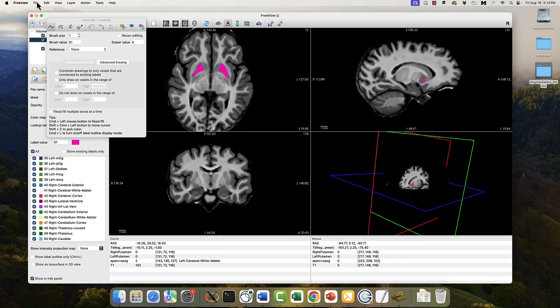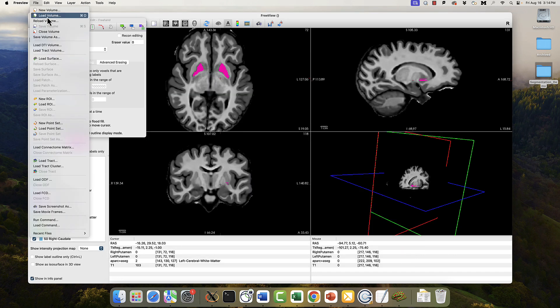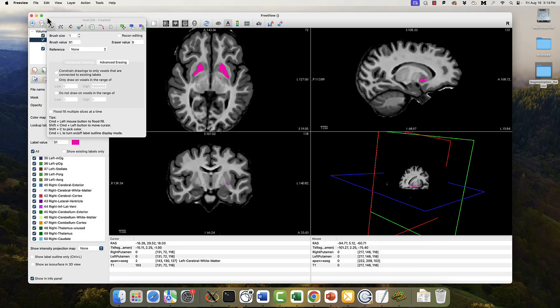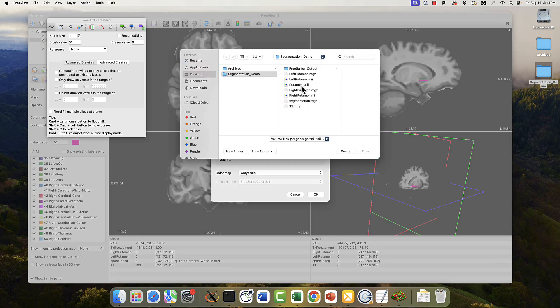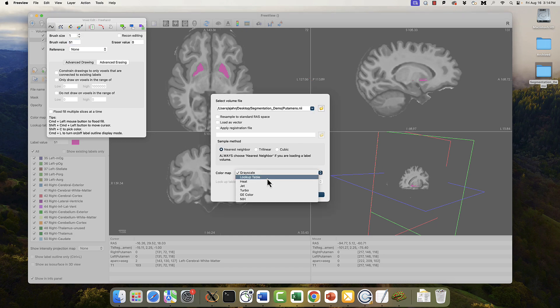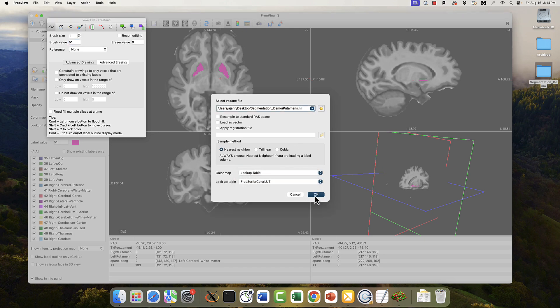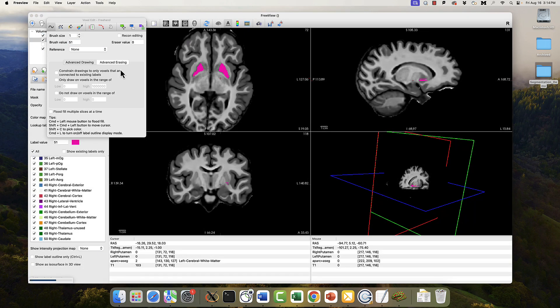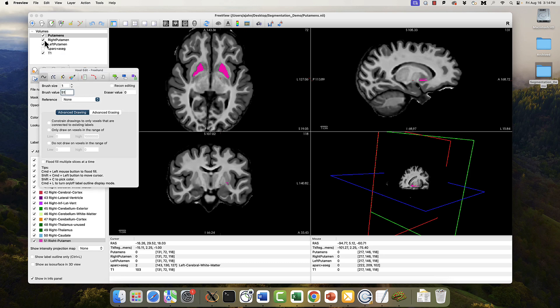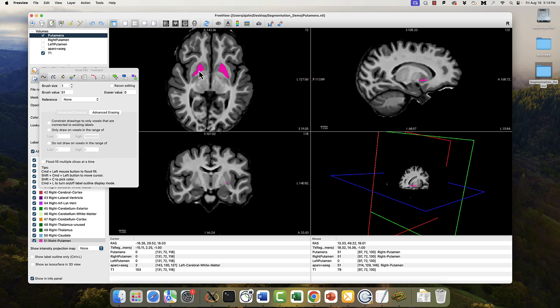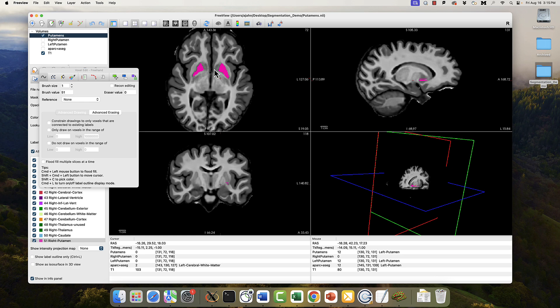And now I can look at this updated combined segmentation file by loading putamens. And same thing, color lookup table, okay, that's all good. And now if I look at it, and I can uncheck the other individual ones, putamens contains both of them with the right value in each of them. I believe it's 12 in the left putamen, and 51 in the right putamen. So these are segmentations, again, just for ease of use, to put them into a single file that you can edit, if you want.